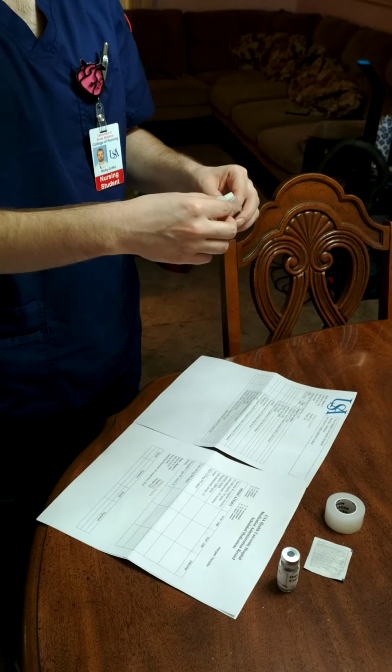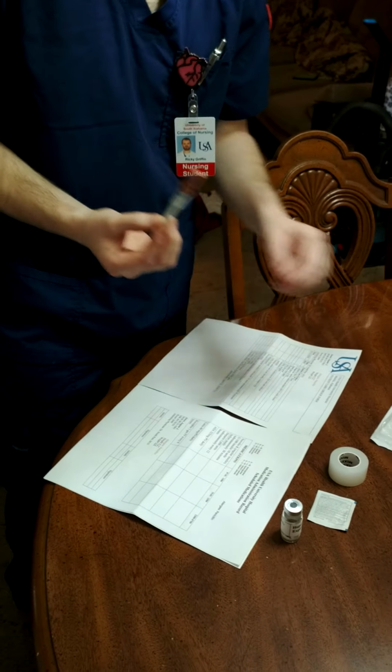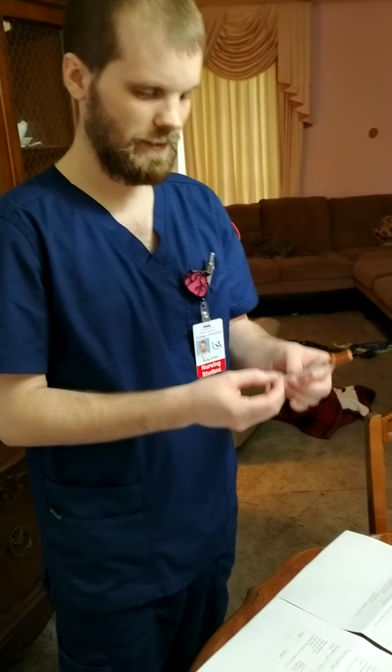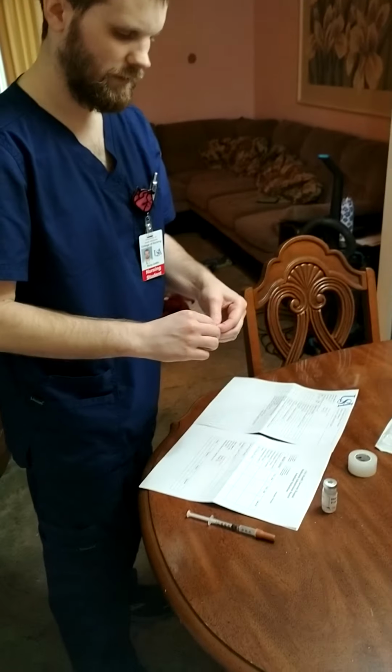Using sterile technique, I will remove the syringe. And in preparation for drawing up the medication, I will fill air into my syringe up to the amount of medication that I need, so it'll be 0.5. I will clean my vial.